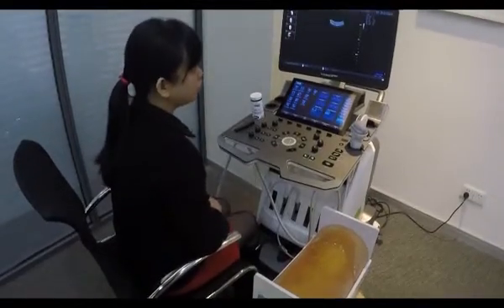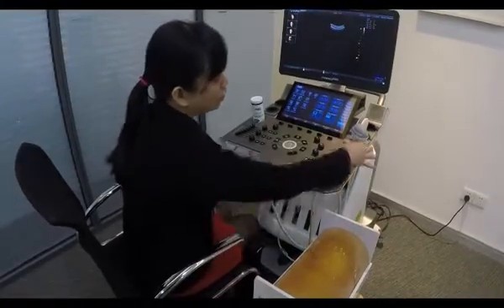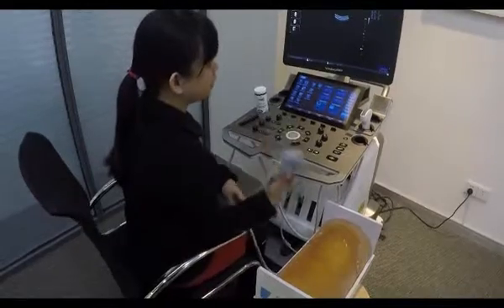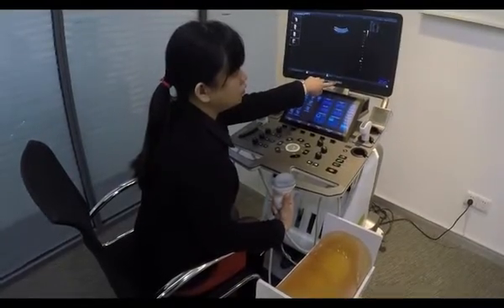Now I'm going to show you about the high quality 3D imaging of Reno. I will be using a 4D volume probe and the high quality 3D imaging is available in Reno 380.